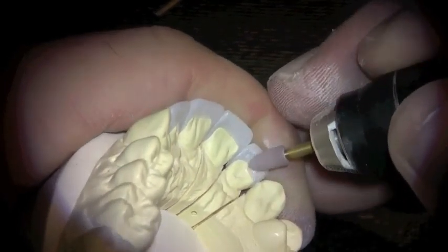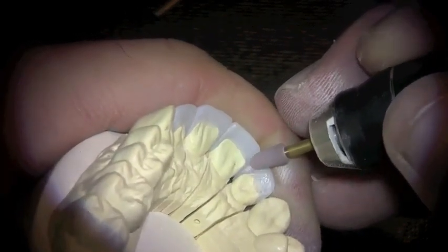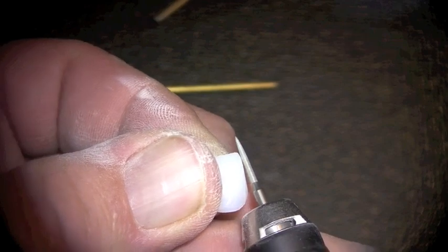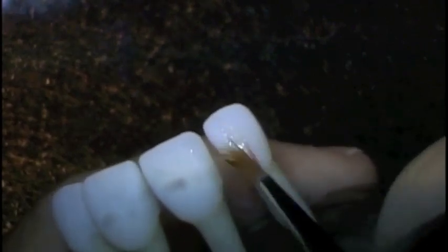Here I'm using another one of the medium grit Brasseler's lithium disilicate grinders to clean up the lingual area close to the margins. I don't worry about chipping with that. I can get right up against the margin. And again, I'm trying to tune the tooth to look individual and working with the relationship with the adjacent tooth.